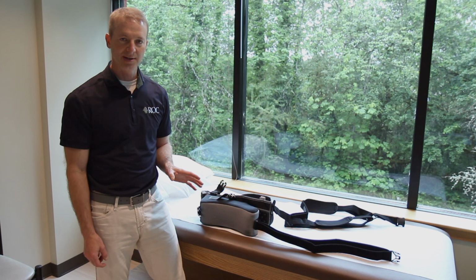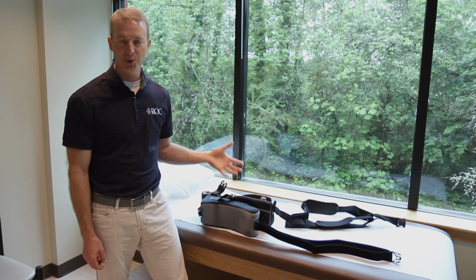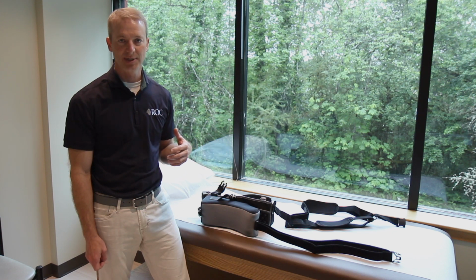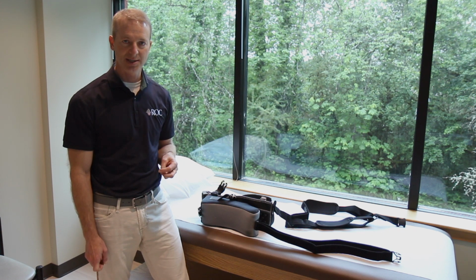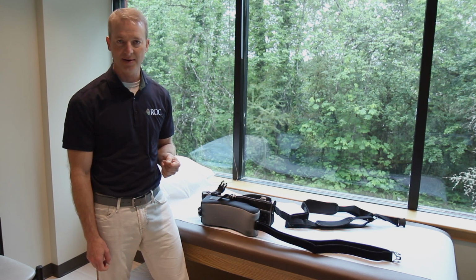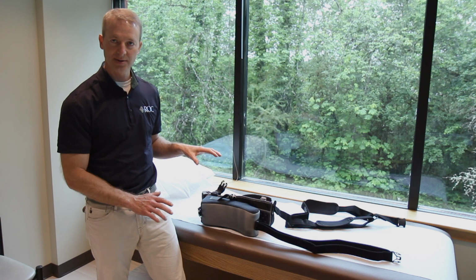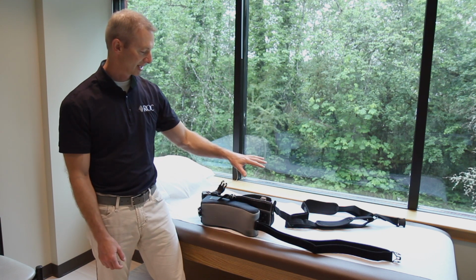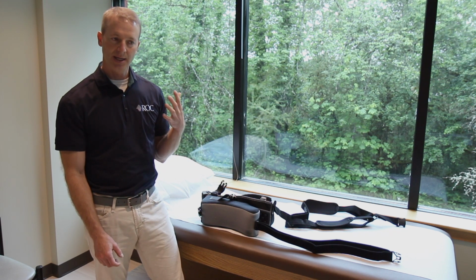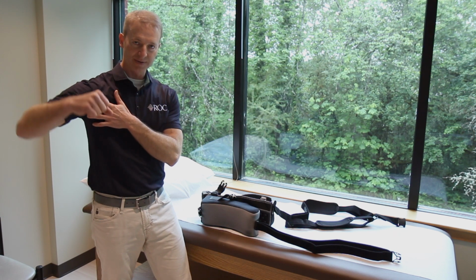One of the most difficult aspects of using a sling after surgery is effectively putting the sling on by yourself. It's nice the first few days or even a week if you have a family member who can assist you putting on a sling, but there are times where you'll be in a situation where you need to be able to put the sling on safely by yourself. I recommend you set the sling up on a countertop or on a table in advance. Position the straps as you see here and have the top of the sling open. And again, the idea that I have is to try to avoid raising the operative arm out to the side.